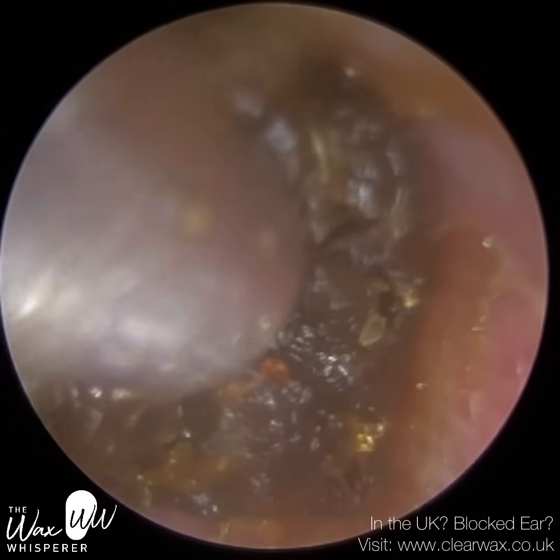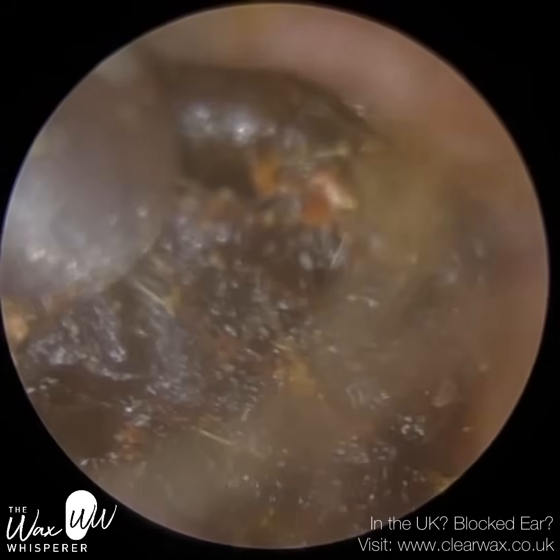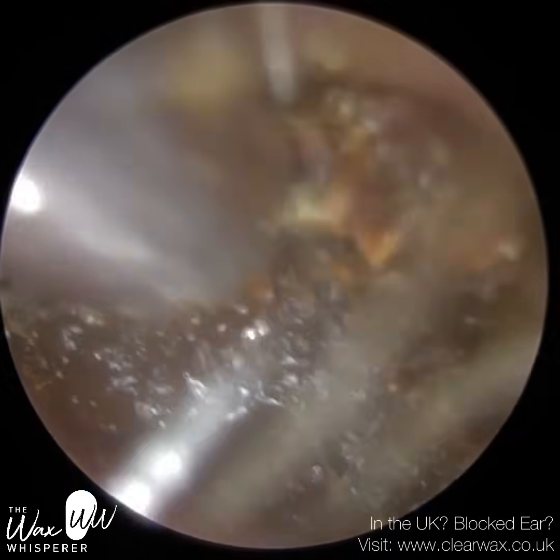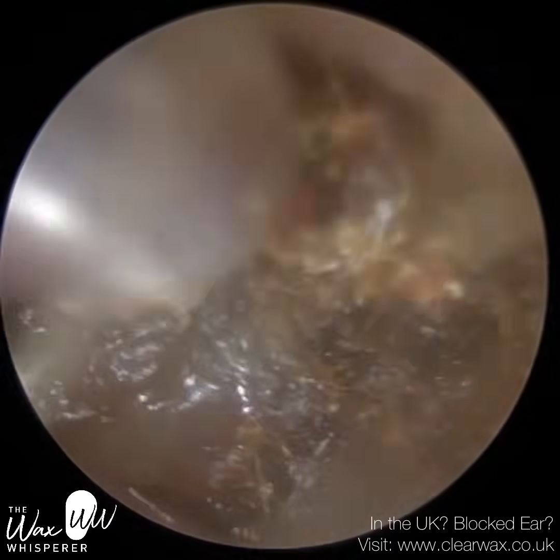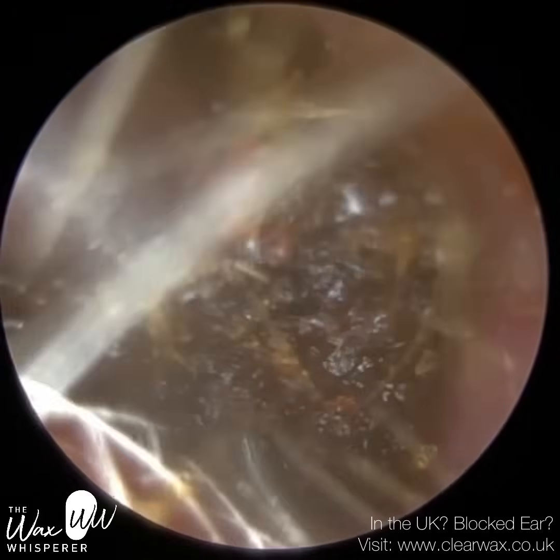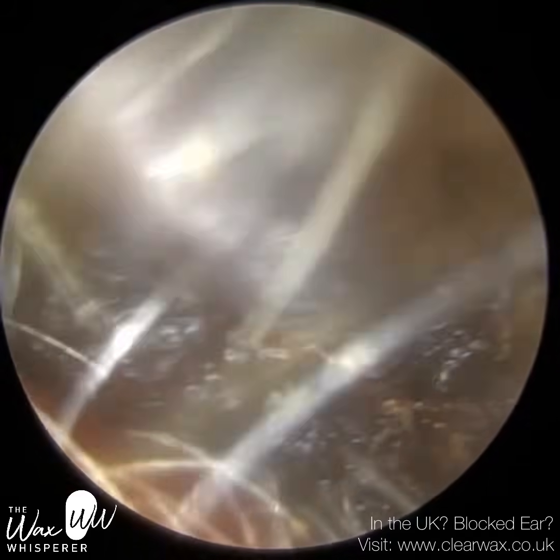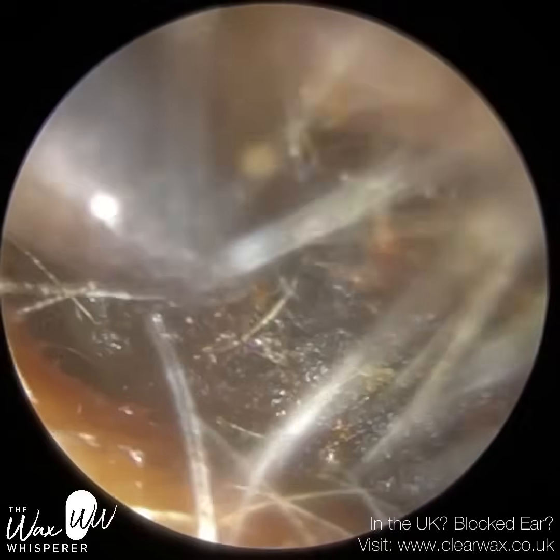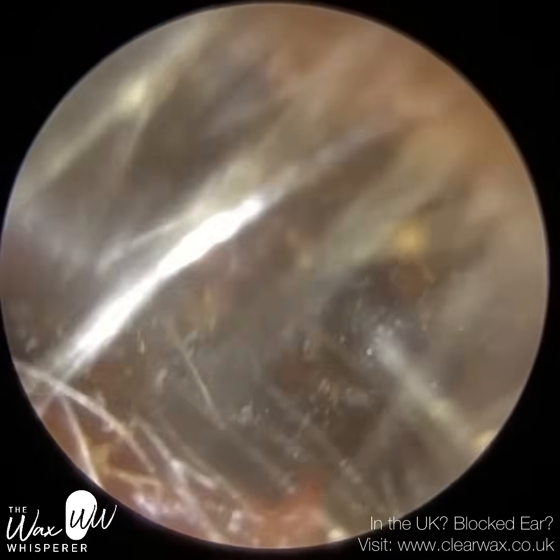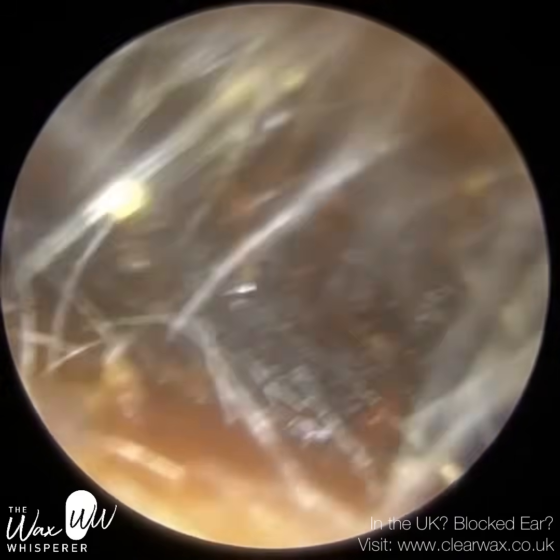Slowly but surely I'm just bringing this away, just teasing this. You can see they've got quite a lot of hairs just at the entrance. I'm just bringing this down away from the roof of the ear canal. You can just see how sticky and loose this wax is. If I'm over-aggressive with the suction probe, it will just detach a small piece of the wax away from the main plug, and I'm going to try and remove this plug in one large piece.